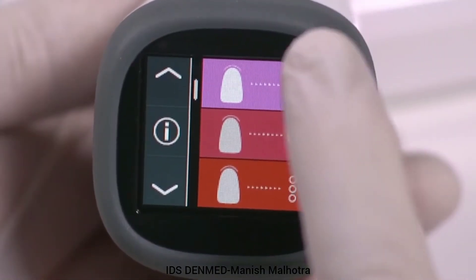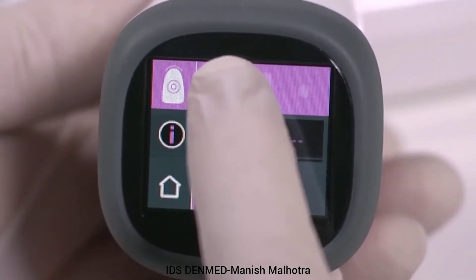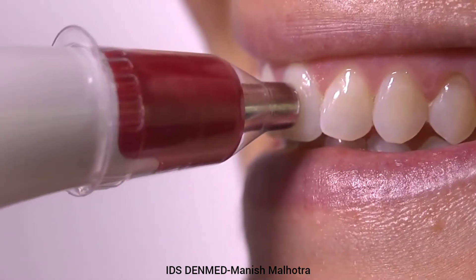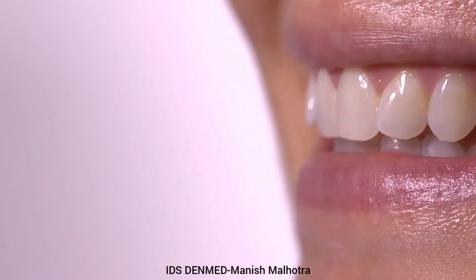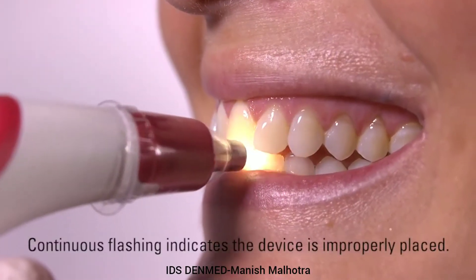Select the basic shade measurement icon at the top of the screen, then select the tooth icon. Position the tip of the device flat against the tooth structure and press the measurement button. After hearing the audible tones, remove from the tooth. A light illuminates and blinks until positioned steady.